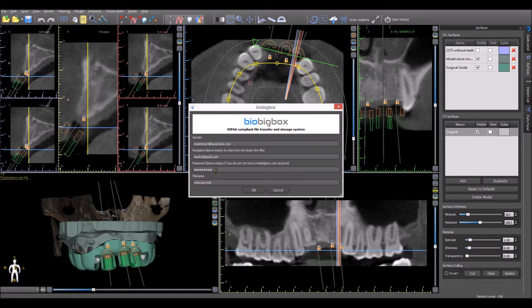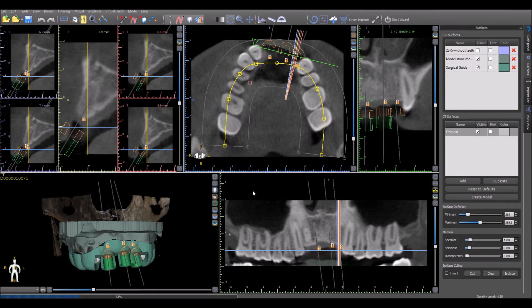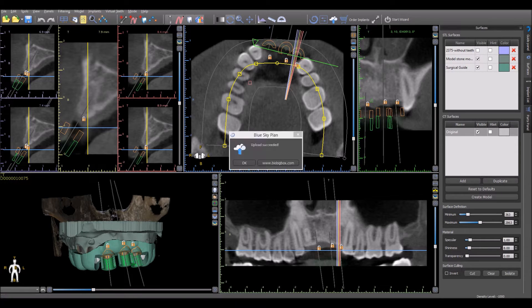Creating an account on BioBigBox is just a matter of entering your email address and creating a password directly at BioBigBox.com. Once you have entered the relevant information, click on the OK button. In the bottom left, you will see a progress indicator showing that the file is being sent. When the file has been sent, you will receive a confirmation on the screen and the recipient will receive an email allowing them to directly download the file or to view it in their online BioBigBox account.